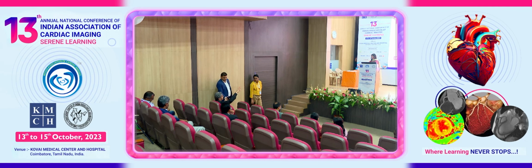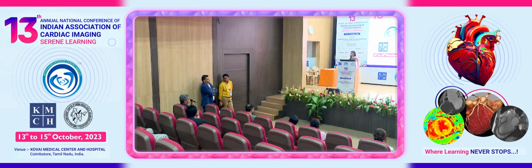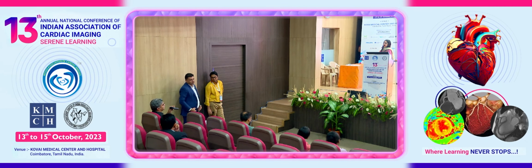For a lesion where the values suggest ischemia, say 0.75, if I do a stress test or stress thallium on him and there is no ischemia, how does the cardiologist look at that lesion? They will look at the stress test, not the CT-FFR.